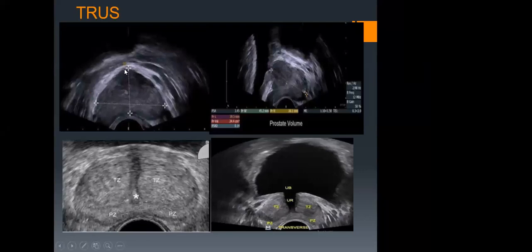Again, this is our onion. This is our prostate. And as you can see, it is difficult for us here to tell the zones of this prostate. This is because this looks normal. Like I said, in a normal prostate, it is difficult to split up those zones unless you are doing histopathology. But this is our onion shape.